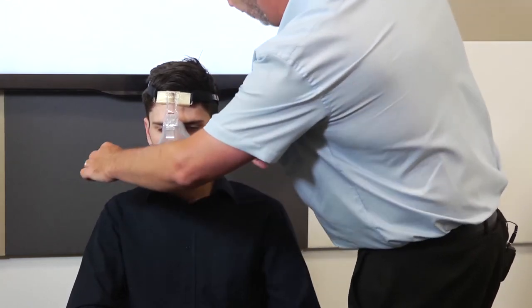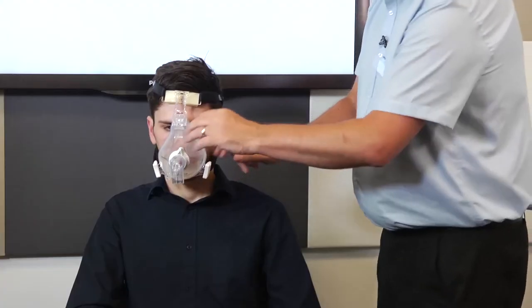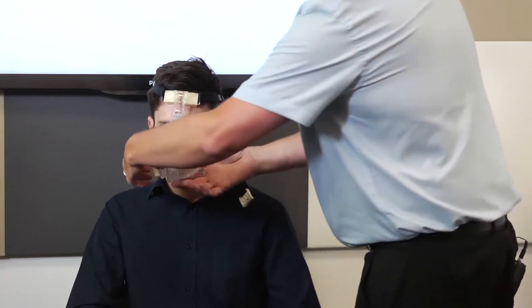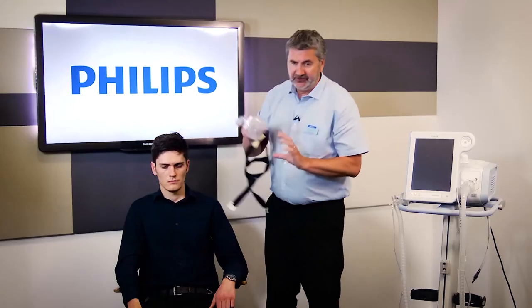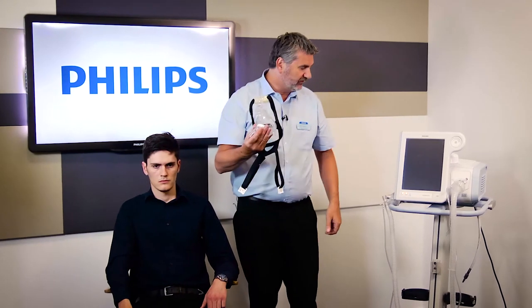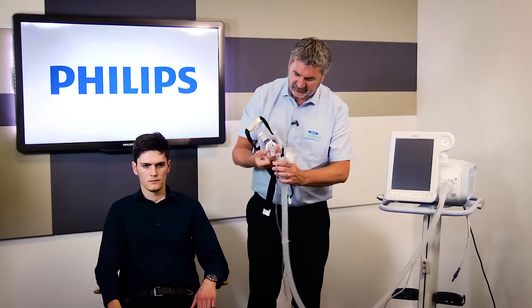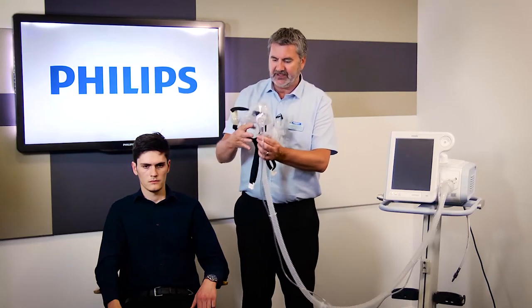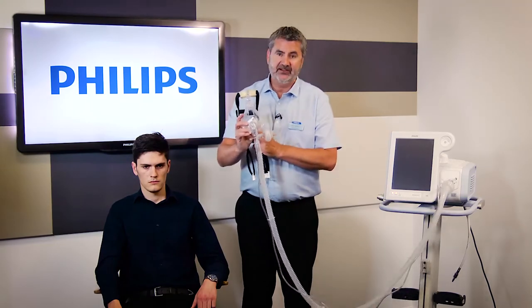Because of the leak tolerance of the V60 and that really good auto-track sensitivity, the mask just has to be placed on their face — not really, really tight. Same thing: on and off just with the clips. That's the mask, that's the circuit. Mask on the patient, just connect your circuit up to the mask, very simply like that, and then we'll turn the machine on, which will be the next section when we can set the machine up.